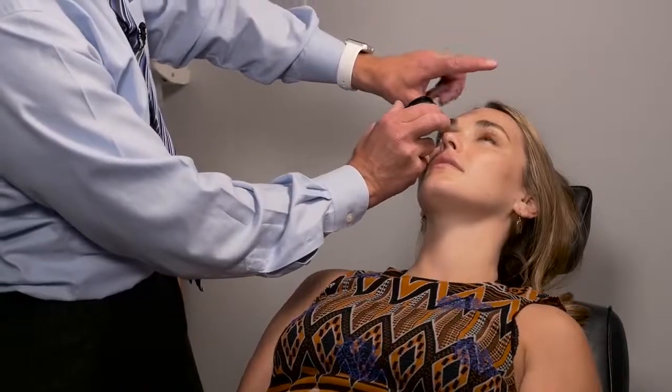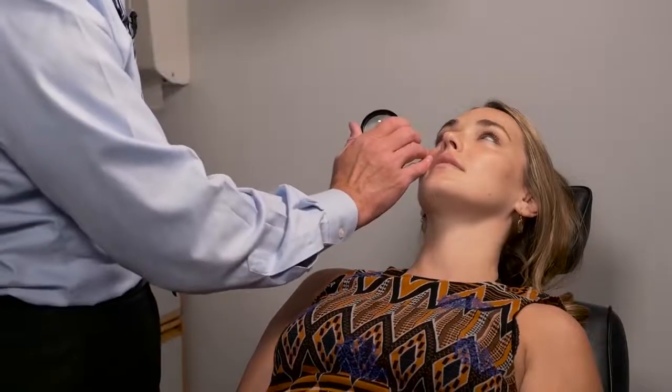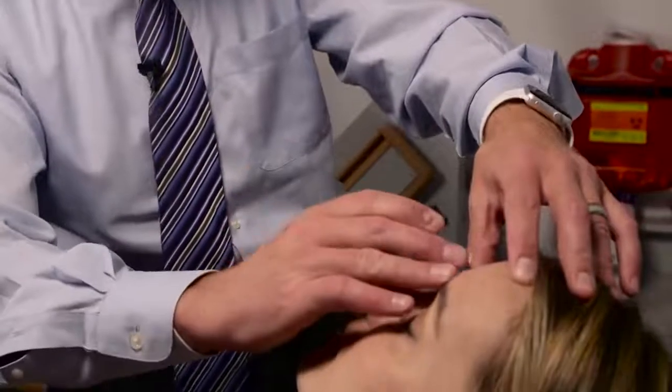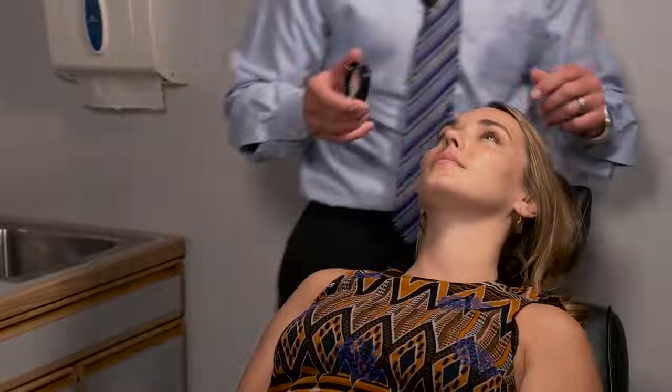I look up at her superior retina, and then you look up and to the right. So this is her right eye. I always start superior and then work temporal. So up and to the right, and then look over to the right. All right. To see down and to the right really well, you can come from up here or even from the other side of the patient.